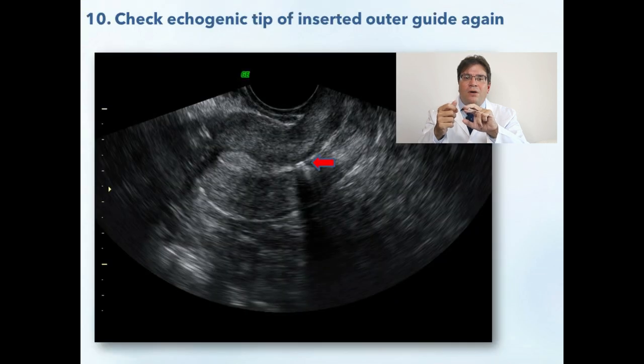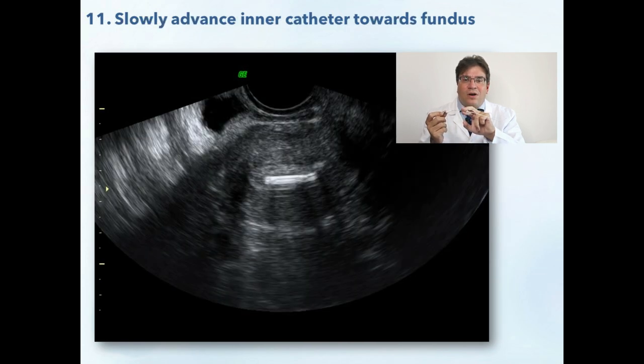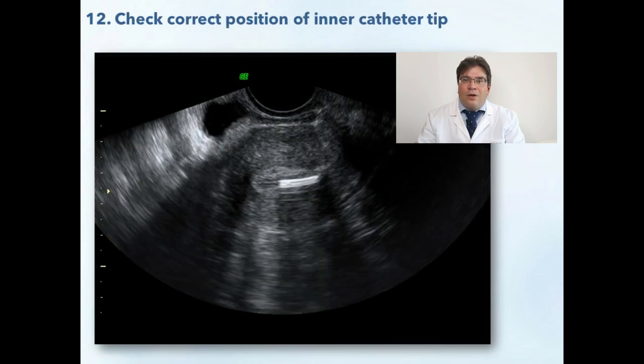Now you should again obtain a perfect sagittal ultrasound image, carefully observe the echogenic tip of the inserted outer guide, and start slowly advancing the inner catheter towards the fundus. Although the inner catheter does not have any specific echogenic marking, due to the high resolution it is readily visible. You can slowly advance the inner catheter to your desired position, usually 1.5 to 2 cm from the fundus.